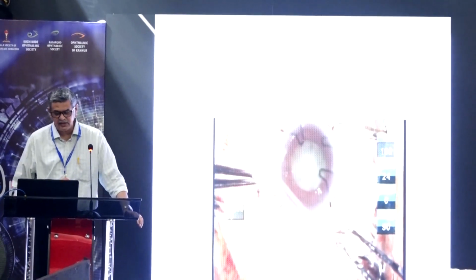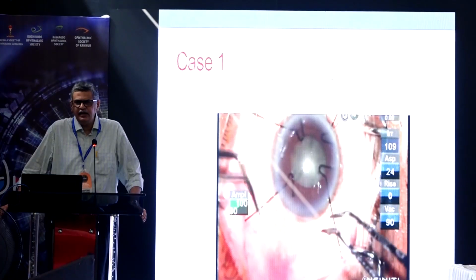So I'll just briefly show 3 cases of 3 different severities. Now, this was an eye where I did the rexis.